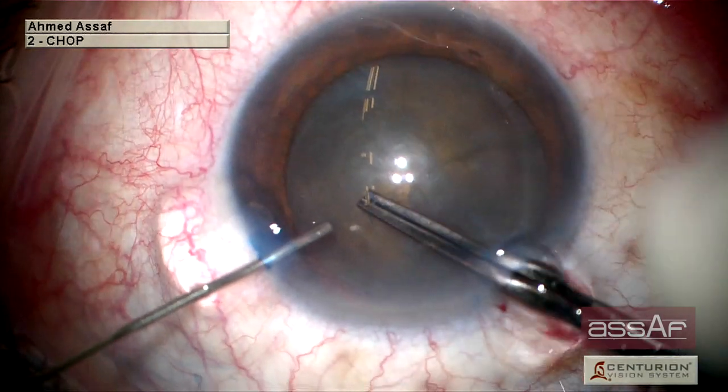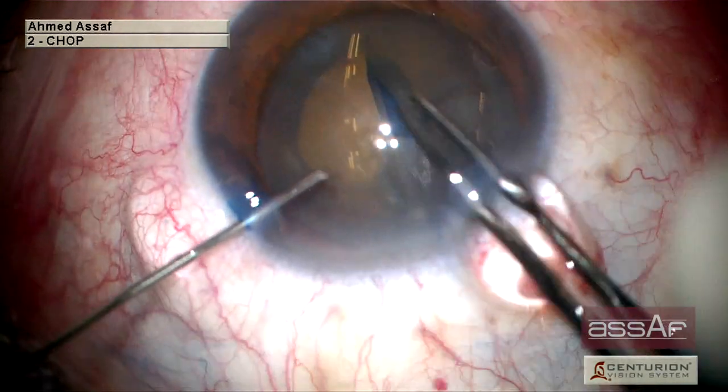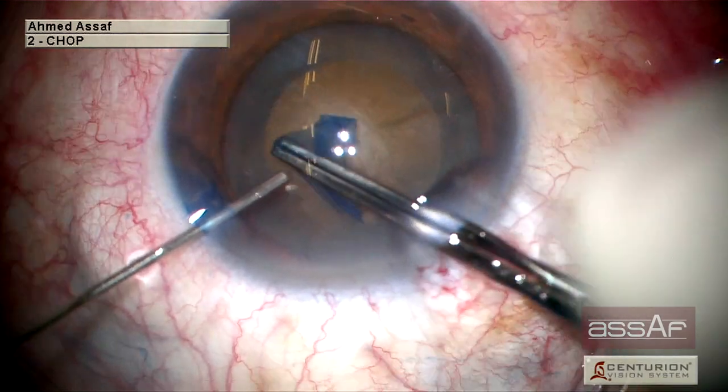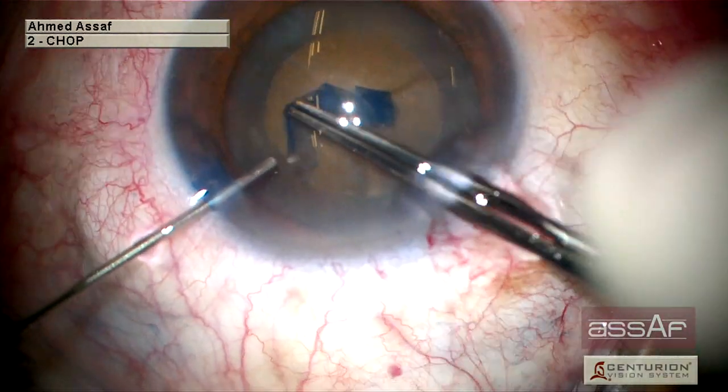In this case, it is preferable to reduce the ultrasound energy inside the eye to as low as possible. We can use the pre-chop or phaco-chop techniques, or of course the femtosecond laser can pre-cut and soften the lens nucleus before emulsification with the ultrasound.